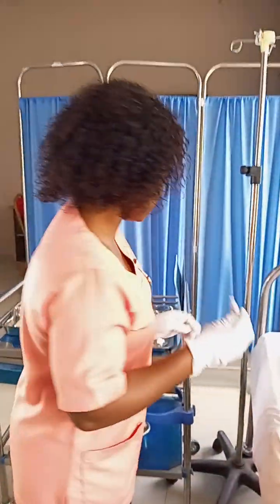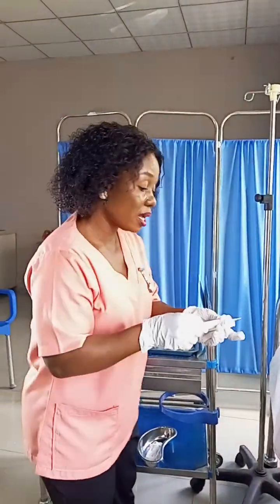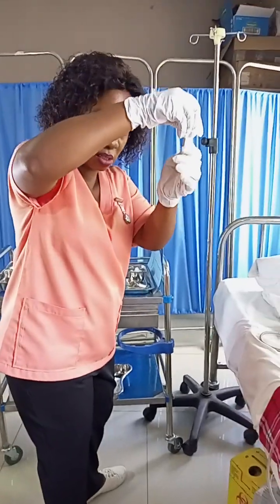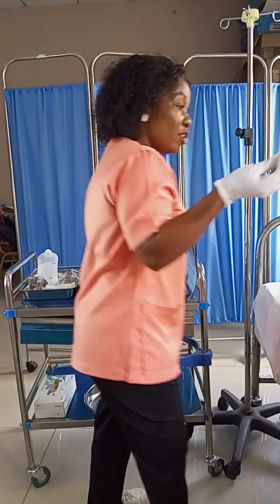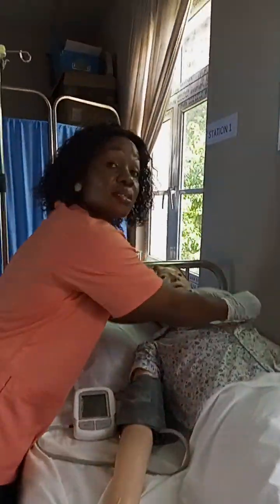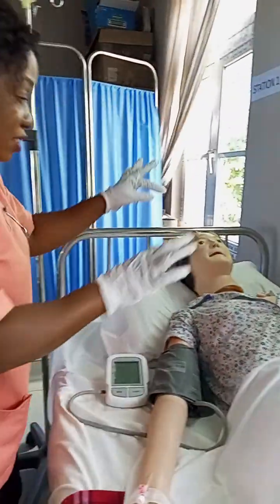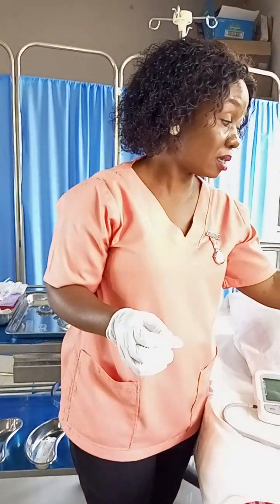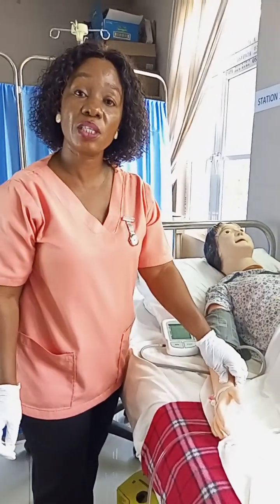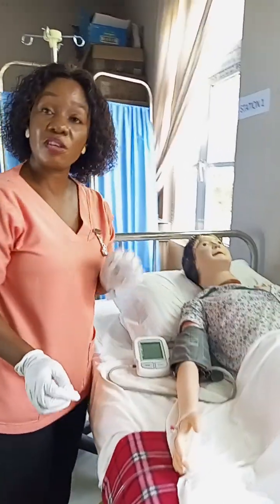The thermometer. Of course, I'm using a spirit swab, cleaning from up to down, and discarding it in a receiver for your swab. Then you put it under the patient's axilla. You leave it there, and after you place the thermometer, you count your patient's pulse for 1 minute, after which you count the respiration.